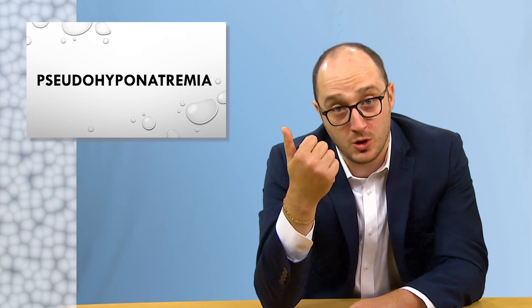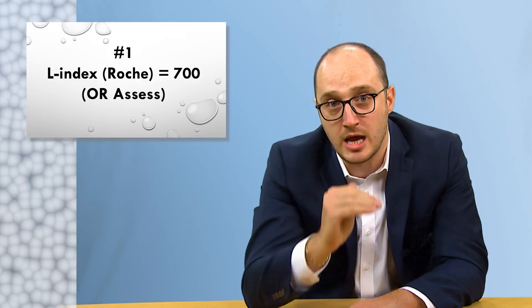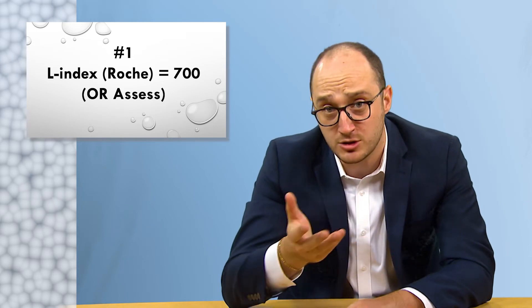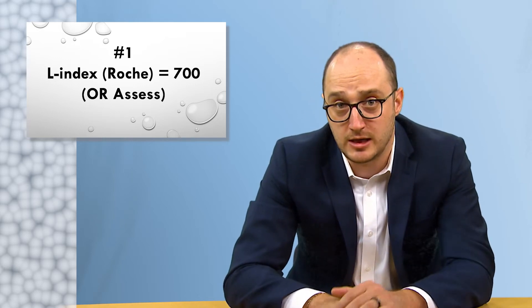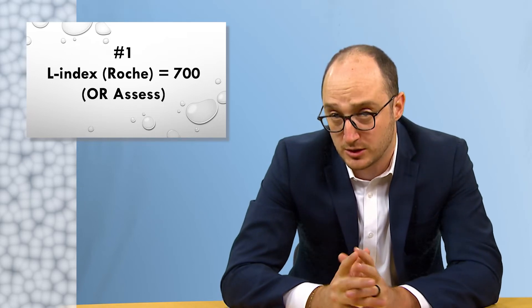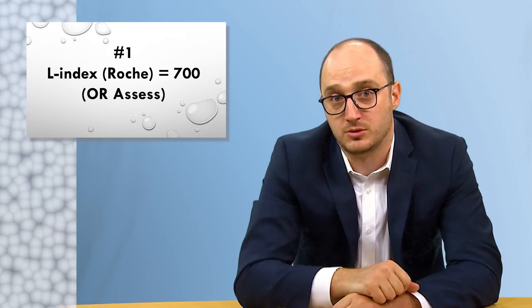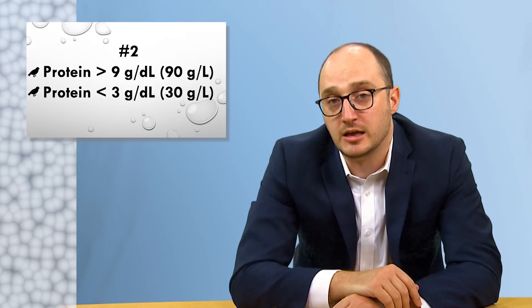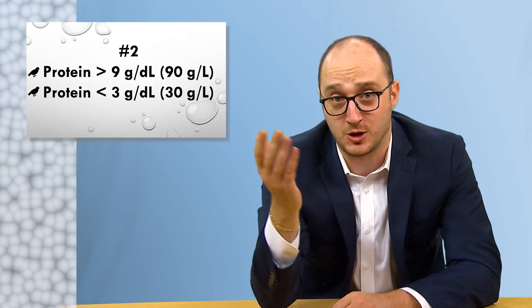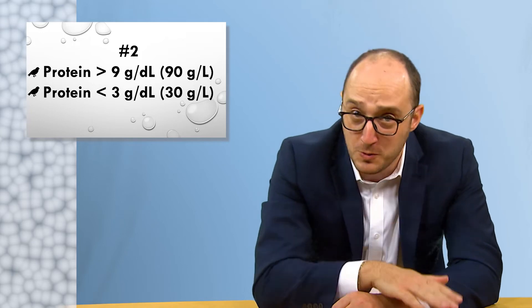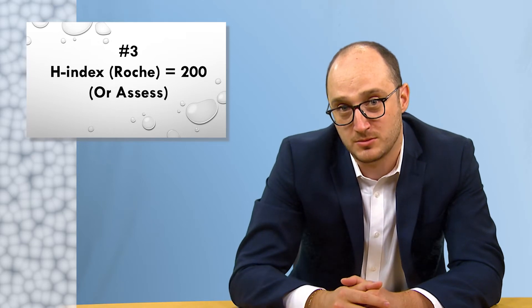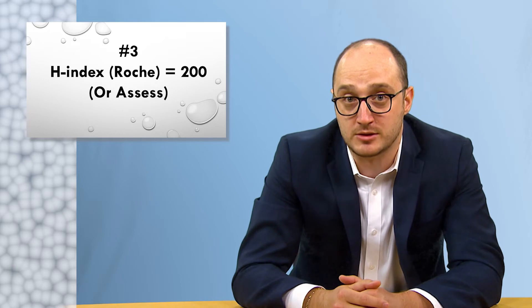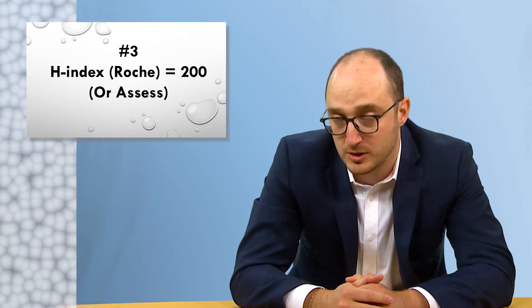If you are a clinical lab, lower your threshold for lipemia interference down to an L-index of 700 on Roche. That may change with larger studies, but with our small data set, this is where we think the threshold should at most be. If you're using another vendor, evaluate that effect using human samples with endogenous lipemia, not intralipid. Lower your threshold for total protein interference for sodium down to at most 9 grams per deciliter. And while we're at it, also set a low threshold of 3 grams per deciliter, because low proteins can cause pseudohyponatremia — that's killing two pseudos with one stone. Lower your threshold for hemolysis to around 200 on Roche. If you're using another vendor, reevaluate the effect of hemolysis using a total allowable error of plus or minus 4 millimoles per liter, not 10 percent.